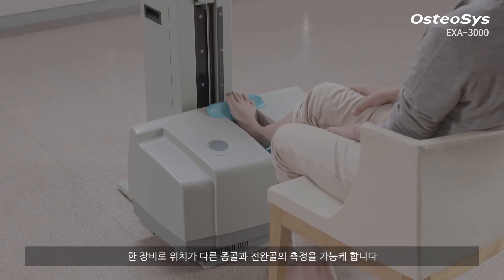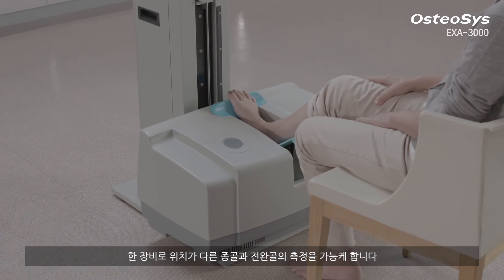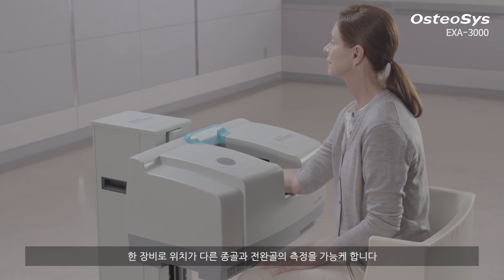As a result, you can measure two different areas — calcaneus and forearm — with one device.